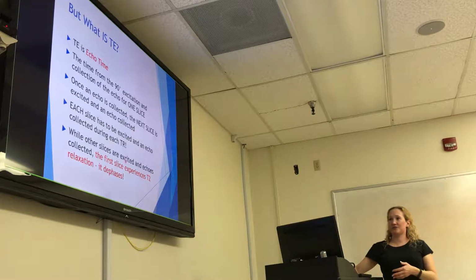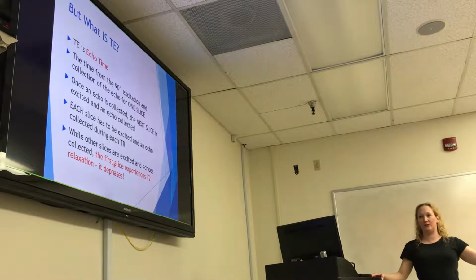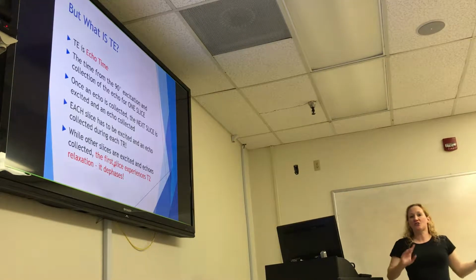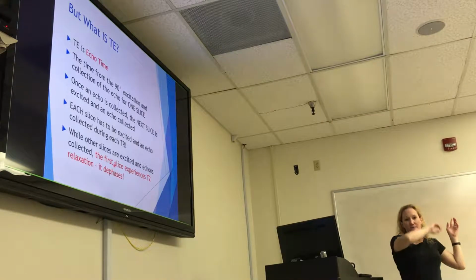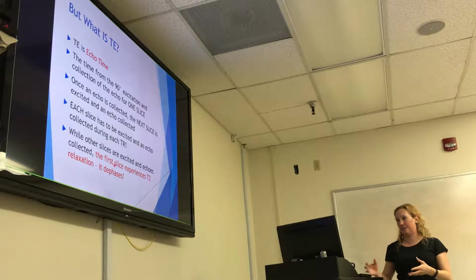And while all of our other slices are being excited, the first slice is just sitting there, right? Experiencing our T2 relaxation, it dephases, all right? And so in this situation, we want to wait a long time before we come back to slice 1, so there'll be a lot of difference in the amount of T2 dephasing that has occurred, right?